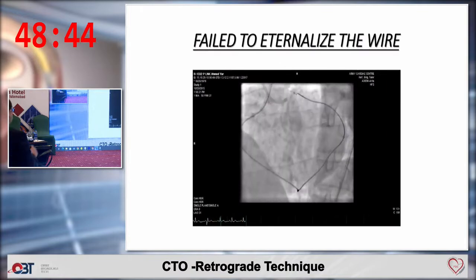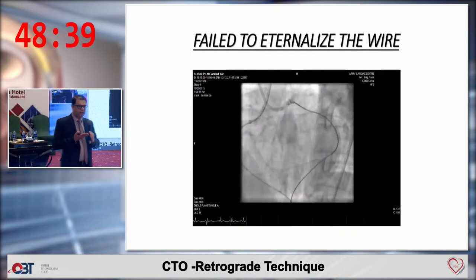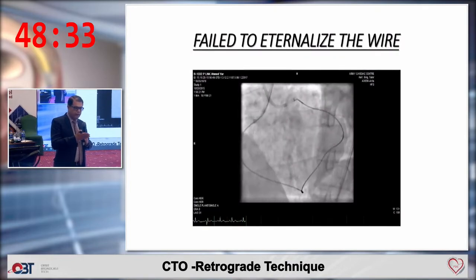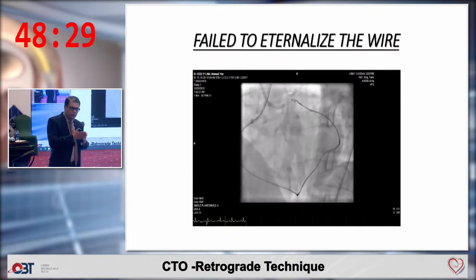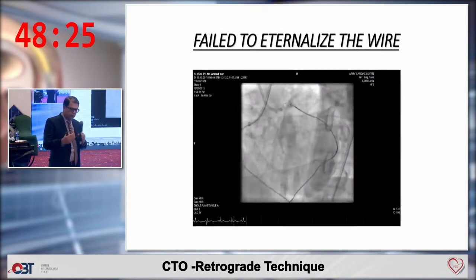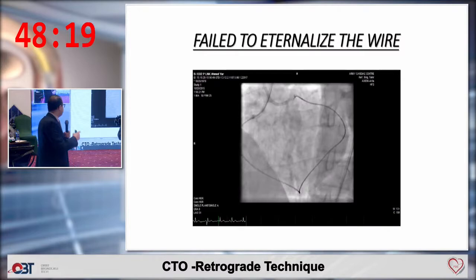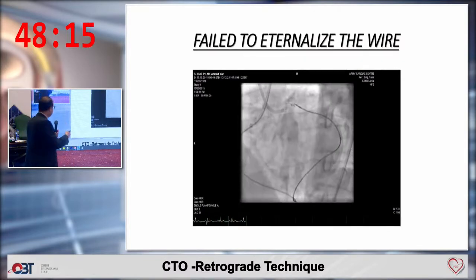So what I think was that it is basically the angle of the guiding catheter that prevents the wire from entering the guide cath. By introducing a guide liner, you might change the angle a bit, and it goes a little bit wedged into the left main. So you might be able to put the wire in that guide liner. But we were not even able to put the wire back even after this. So that was the next step.